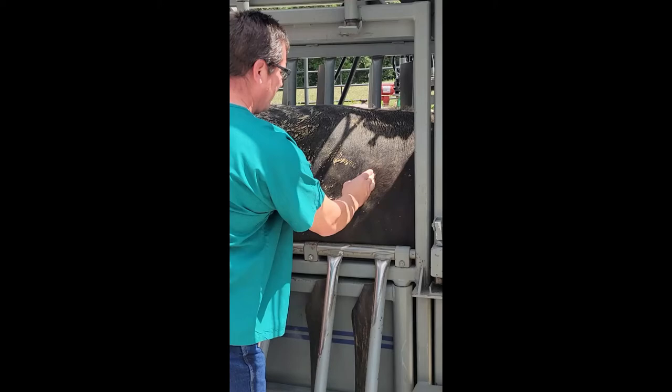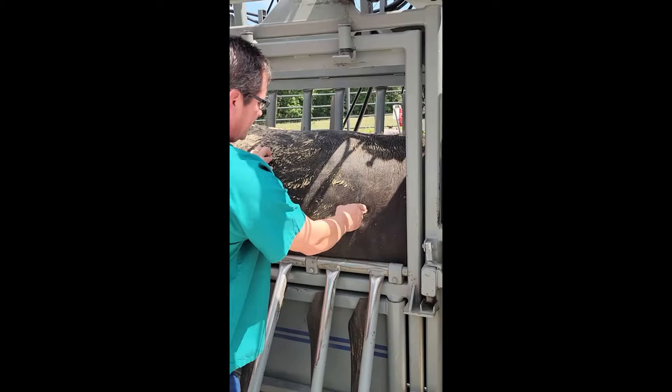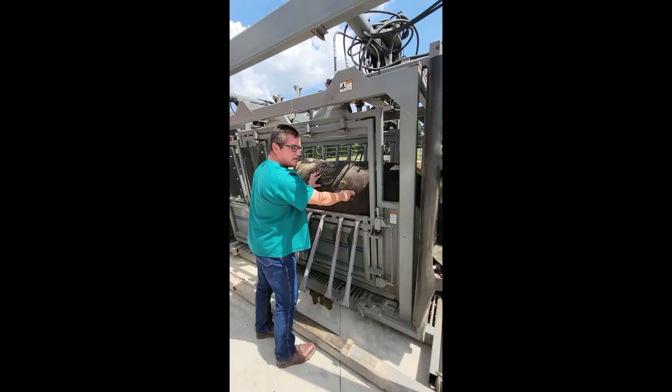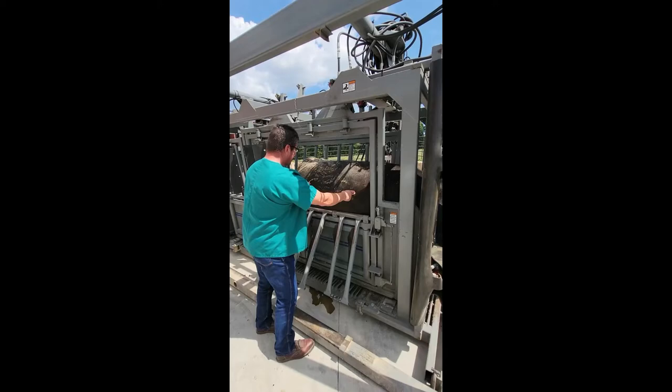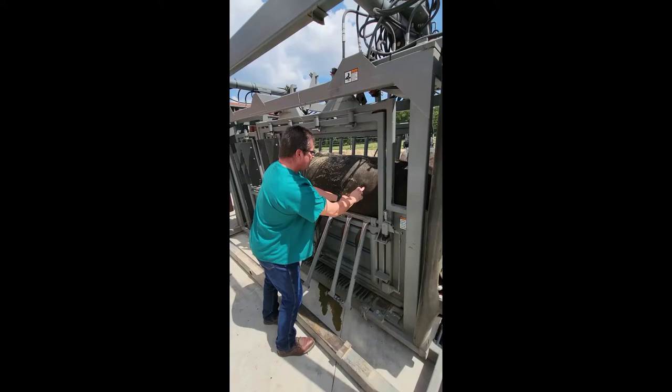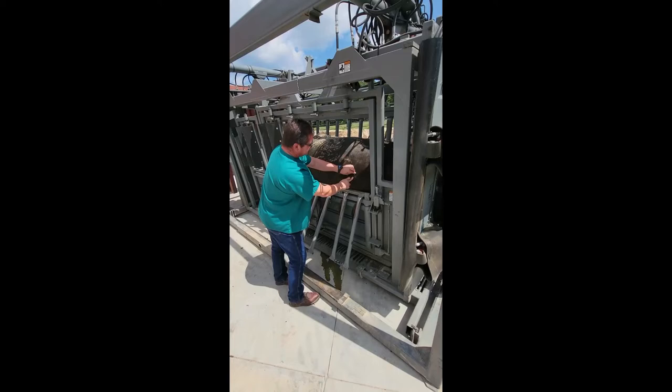Traditionally you draw a line from here to the shoulder, and this would be about the spot where you'd make your decision and enter the thoracic or abdominal cavity. What I like to do is come down just a little bit, so it's more from here across to the shoulder — just a little bit lower than the traditional method.